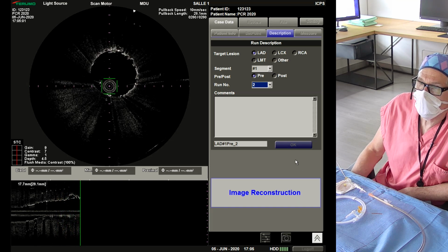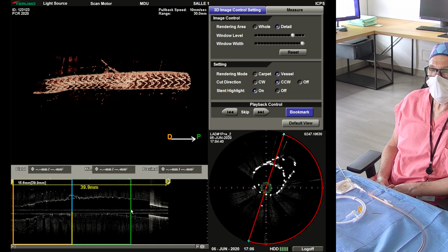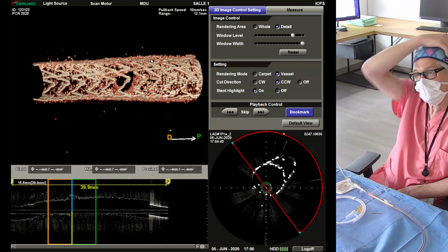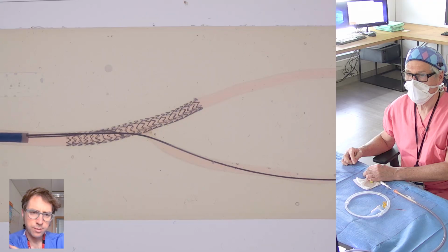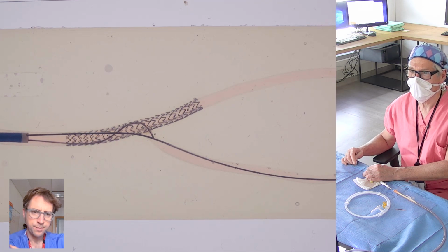The study, of course, is the same, but in front of the side branch, it's clearly better. There is still some malapposition, but not too much. Okay, so now we see clearly the two diameters, distal to the bifurcation, proximal, and in front of the side branch, you can see that there is less strut in front of the side branch, just because we have enlarged the stent proximal to the carina. So it's very nice, because if you go from the up front, you are going in the proximal one. If you go from distal with a pullback technique, you go in the distal one. Okay, so I think this one is good.